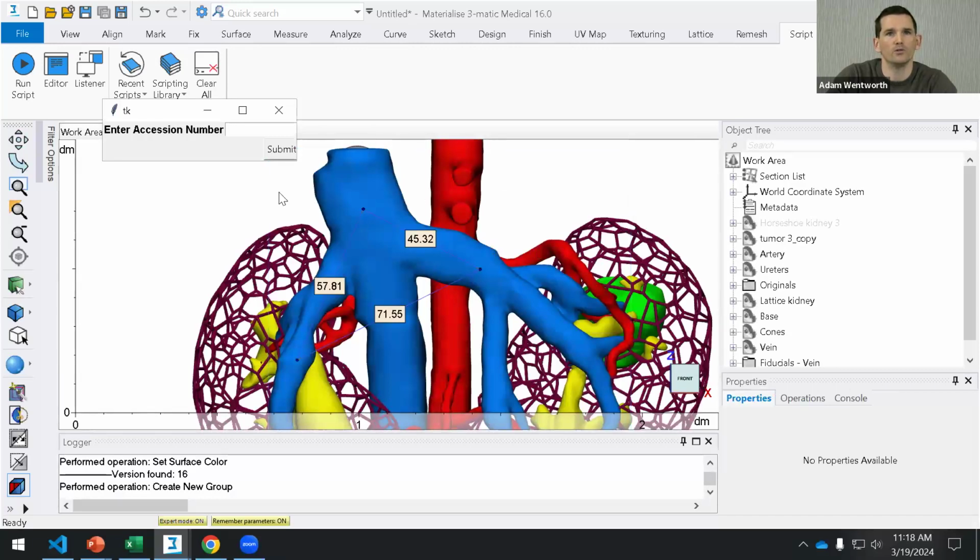Here's a point where we would usually take a screenshot as part of quality control. When the object is actually printed, our technicians will measure the distances between these dots and confirm that they represent within tolerance accuracy to what's been done digitally.